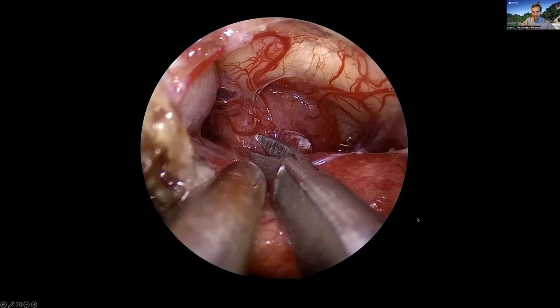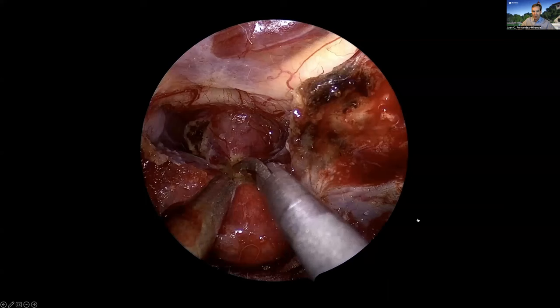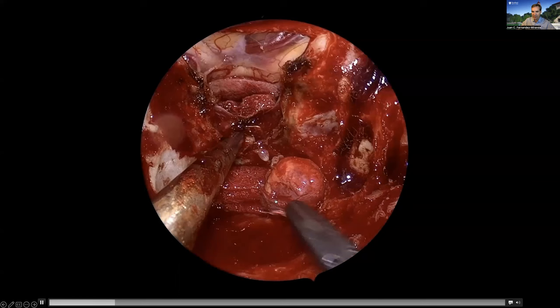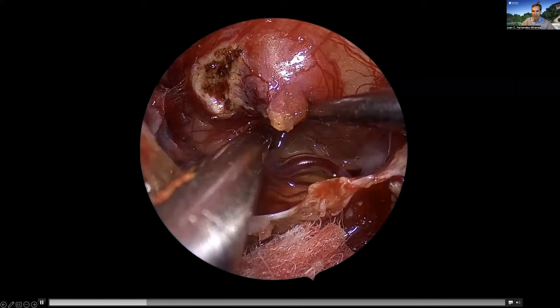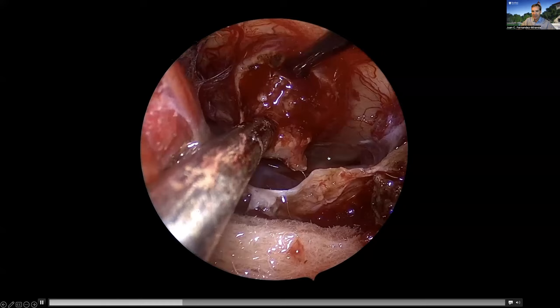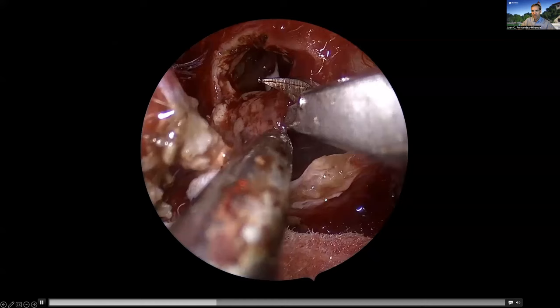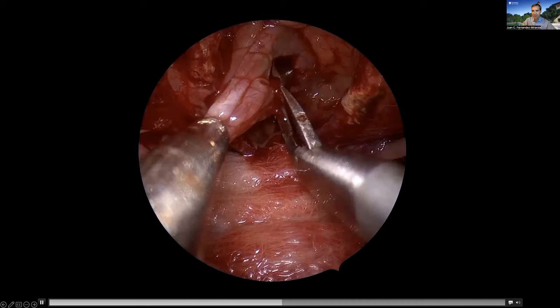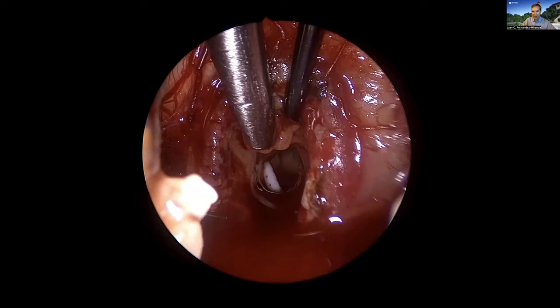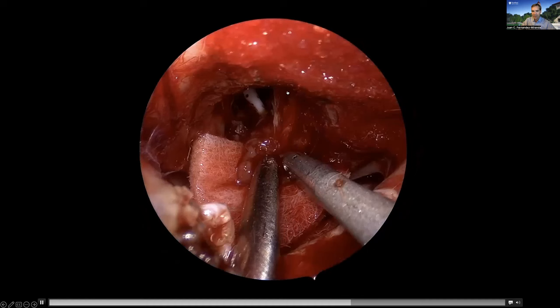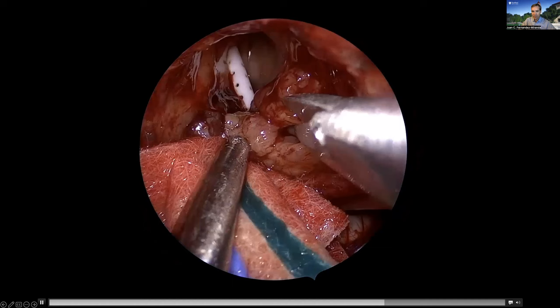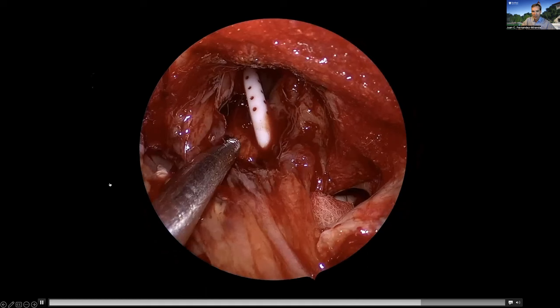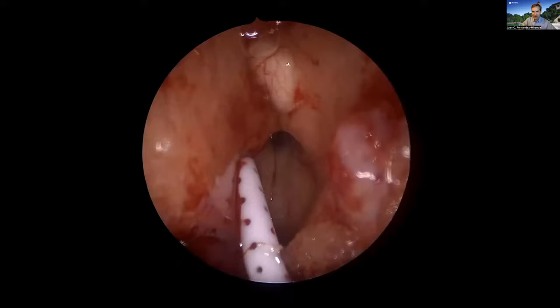This patient had partial hypopituitarism, but I decided it was impossible to remove the tumor entirely without removing the pituitary gland — this was discussed with the patient. The gland is being removed here. Without taking the gland I would not have access. I then opened the dura of the sella, identified my landmarks including the optic chiasm anteriorly and the mammillary bodies posteriorly. The cyst membrane is attached to important nuclei of the hypothalamus, and I dissect in the retrochiasmatic area at the level of the infundibular and arcuate nuclei, right in front of the mammillary bodies, finding a good separation between the tumor capsule and hypothalamus.